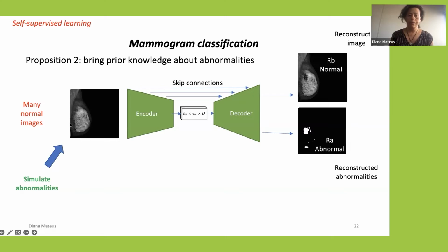So once we have these normal images, we can try to use a UNet-like architecture to segment the content of this image, and we are going to do this in an explicit manner. So we are going to really not only try to predict the mask, but really separate the content into the normal and abnormal part, as we mentioned in the previous slide.